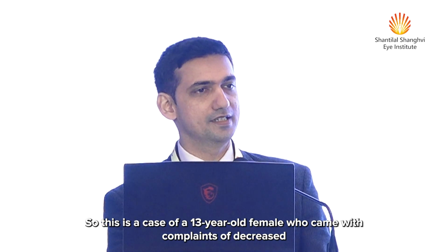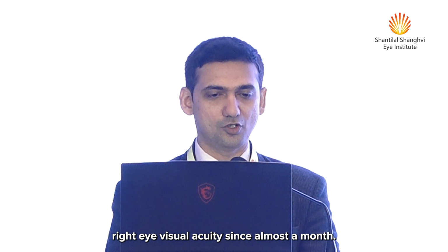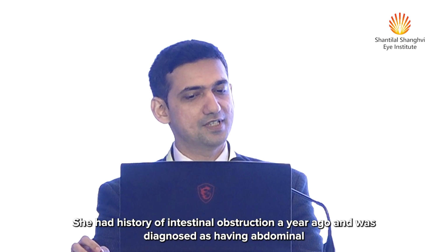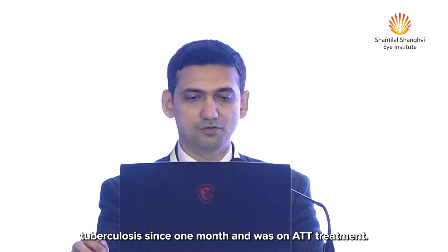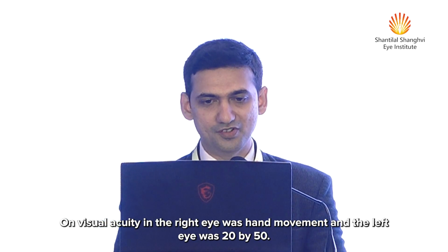This is a case of a 13-year-old female who came with complaints of decreased right eye visual acuity since almost a month. She had a history of intestinal obstruction a year ago and was diagnosed as having abdominal tuberculosis and had been on ATT for 1 month. Visual acuity in the right eye was hand movement and in the left eye was 20/50.